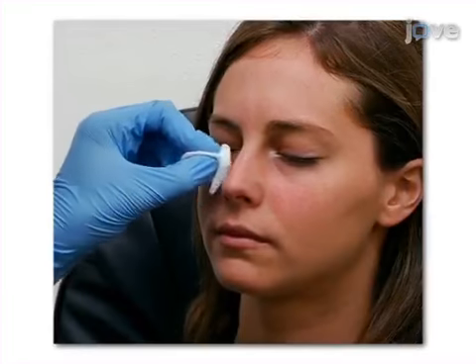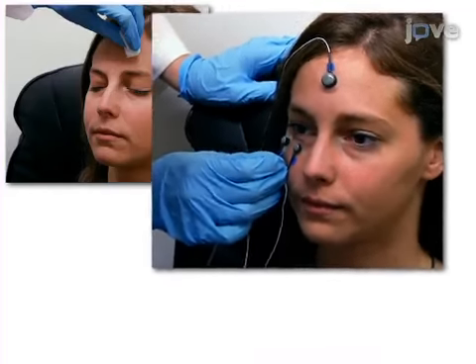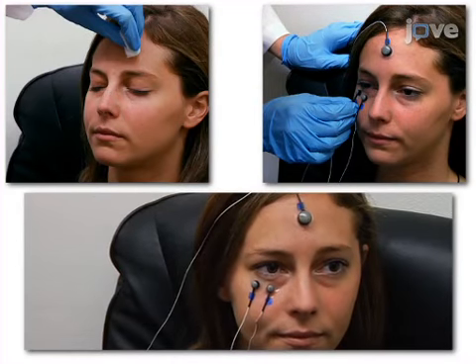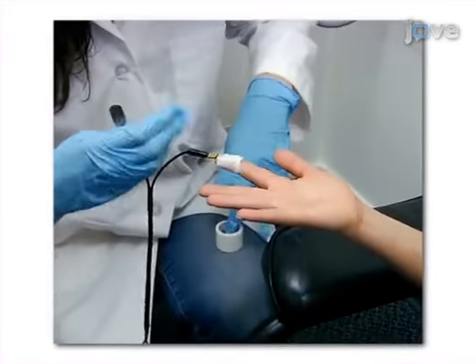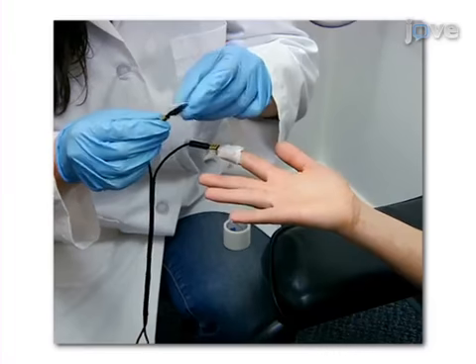This is accomplished by first preparing the participant's skin and attaching electromyography sensors under the participant's eye and forehead. The second step is to assess the participant's sensitivity to electric shock in order to determine the level of shock to be used in the main task.